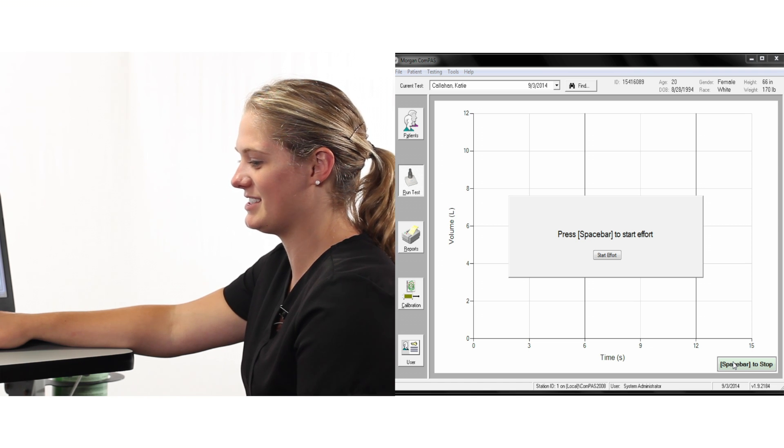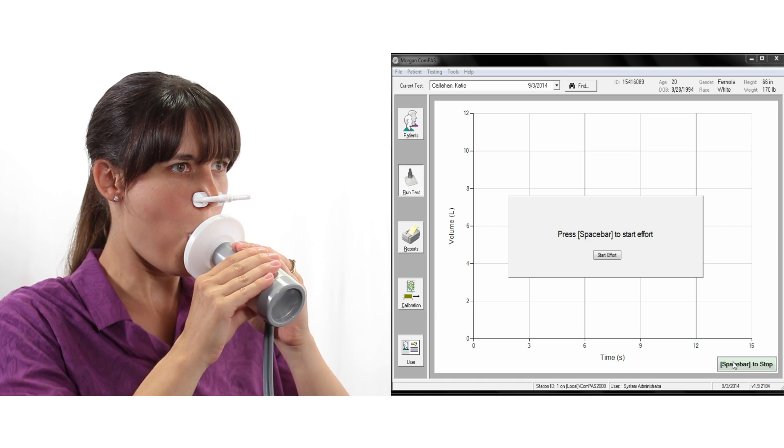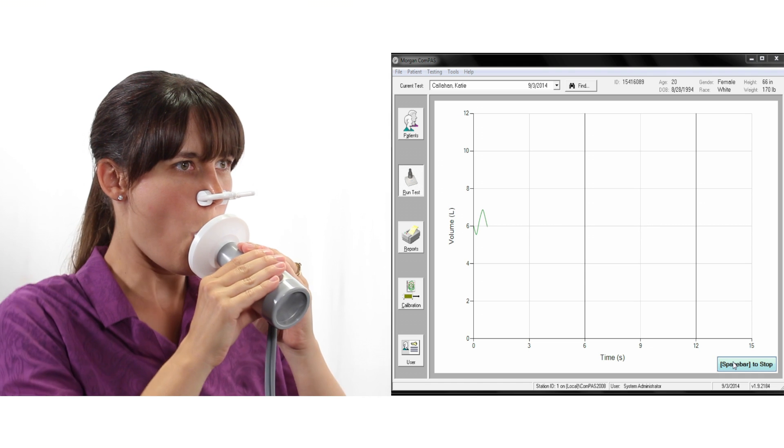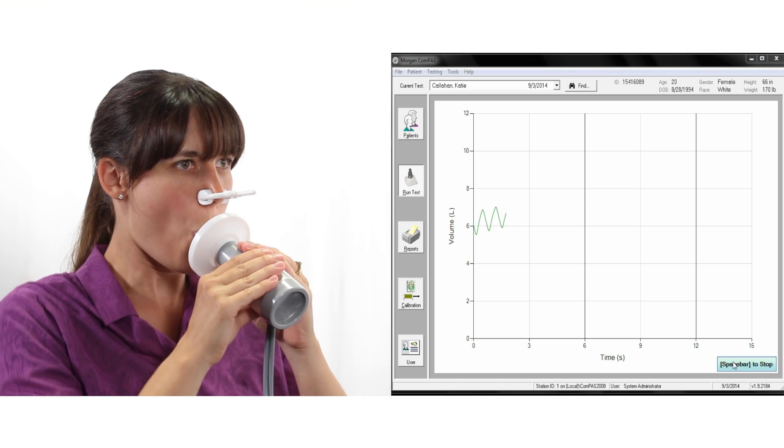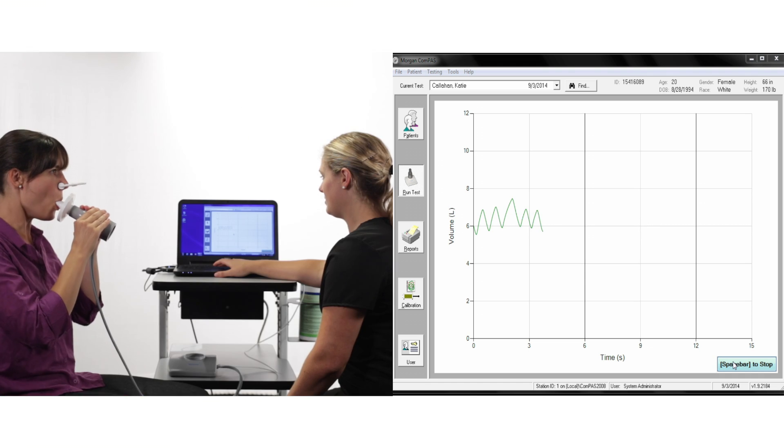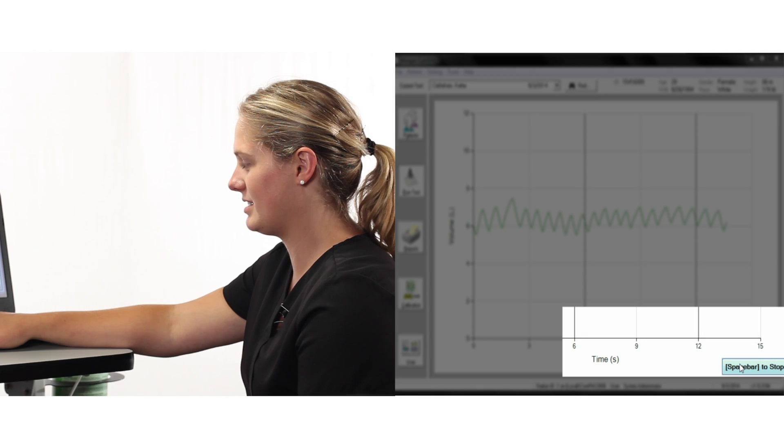Enthusiastically encourage the patient to breathe deeply and rapidly, moving as much air as possible and keep the effort going for 15 seconds.